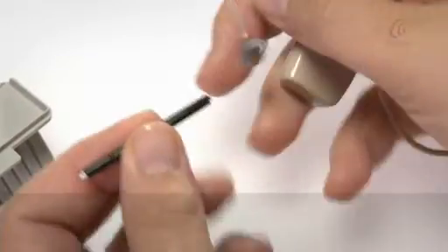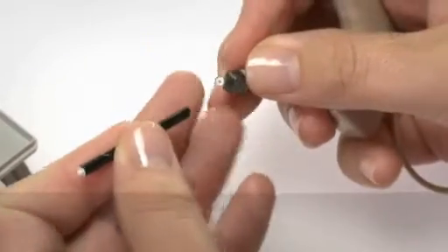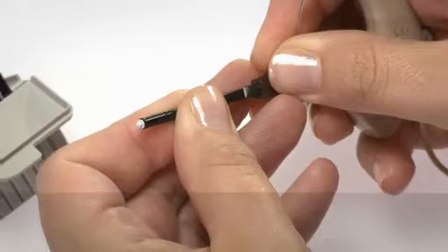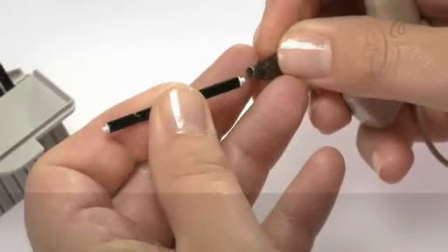Insert the removal tool into the existing Wax filter. Pull the used filter out slowly, keeping the tool straight.